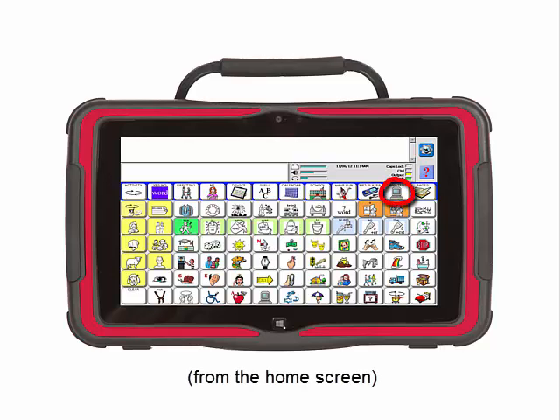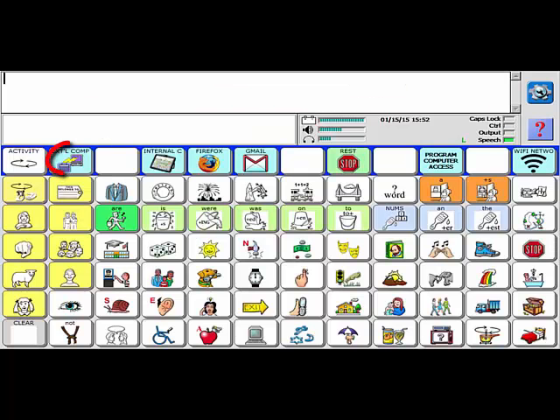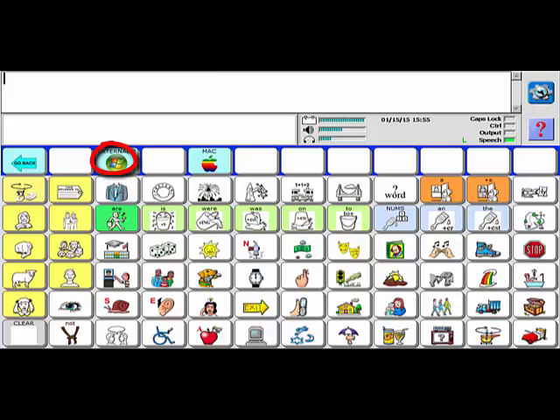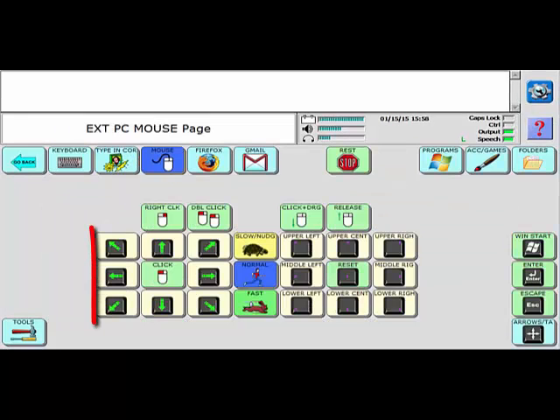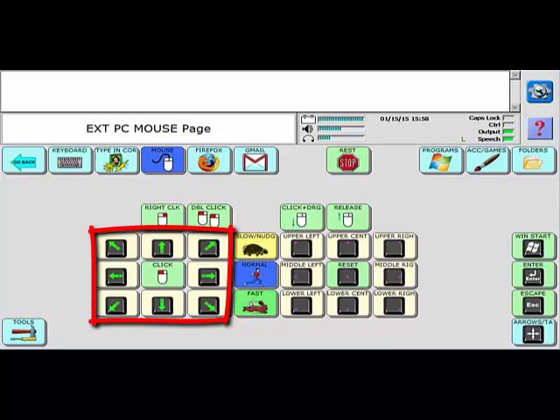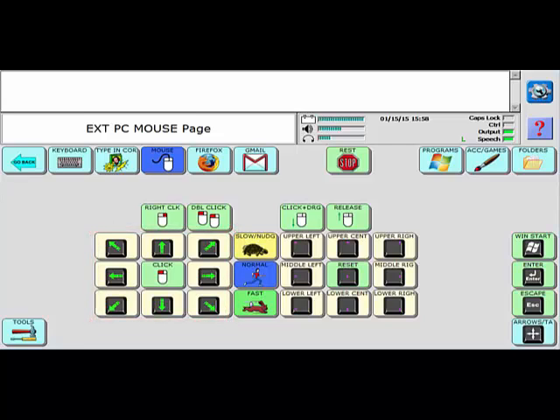For example, in Unity, select Computer Access, then External Computer, then External PC, and then finally Mouse. Now when you select one of the green arrows, the cursor on your computer screen will move in that direction. To stop the cursor, simply select any key on the display.